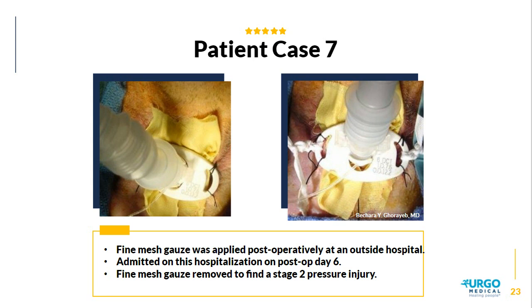We weren't able to visualize the skin underneath until a day later, and at that point we discovered that the patient had a stage 2 pressure injury. And in this particular case, we came to find that even Zeroform, a commonly used dressing, wouldn't necessarily prevent pressure injury development.